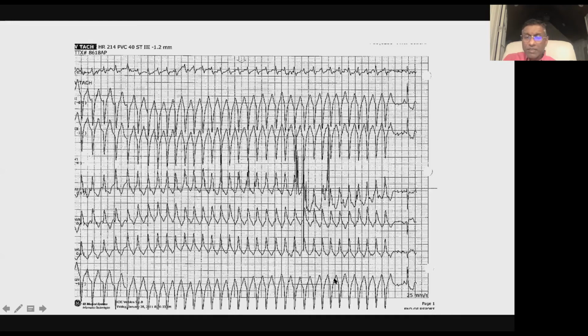I think there's possibly one candidate somewhere over here where there's a P. Yeah, here's one right here. I think this is another P, this is one P, and so forth. It might sound like I'm stretching my imagination, but as you keep staring and looking for them, you'll find them. You will find them.